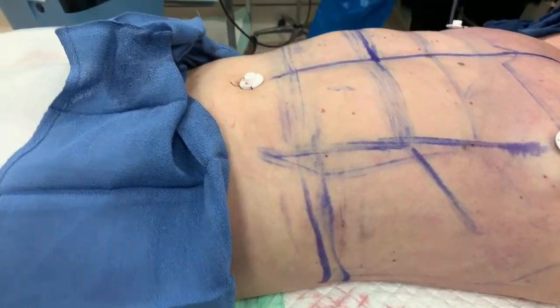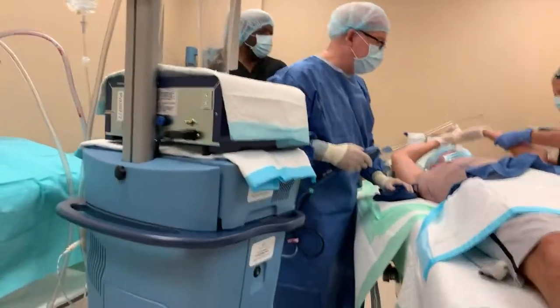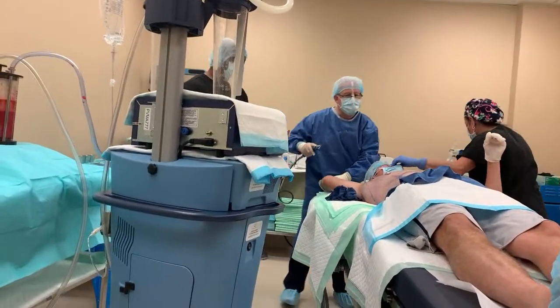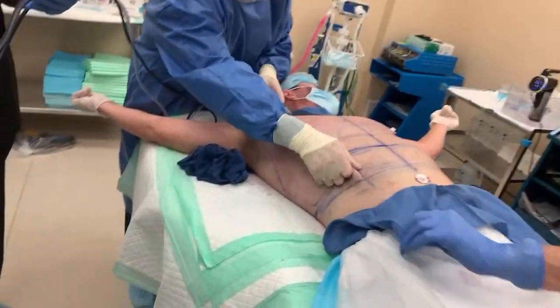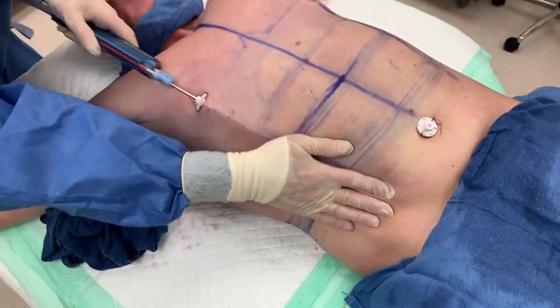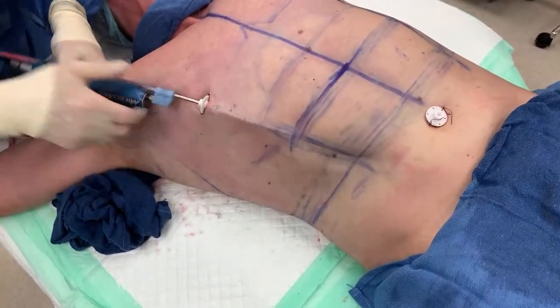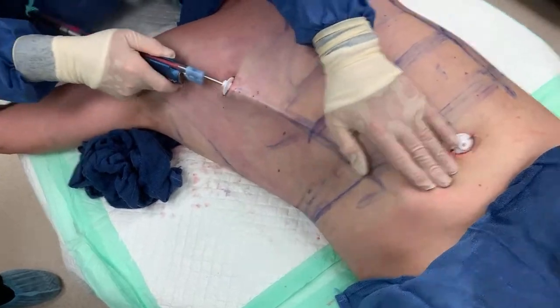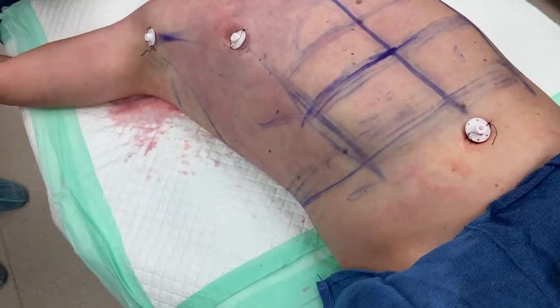Let me turn them a little bit to the side — turn this side down. Let me get that — yeah, very nice. Actually, before I do that, let me get some of the area a little bit better. You alright? Yeah, it hurts a little bit — yeah, I'm way down where I don't have to be, just a bonus. Yeah, that looks good. Go ahead and turn them now — let's do the sides.